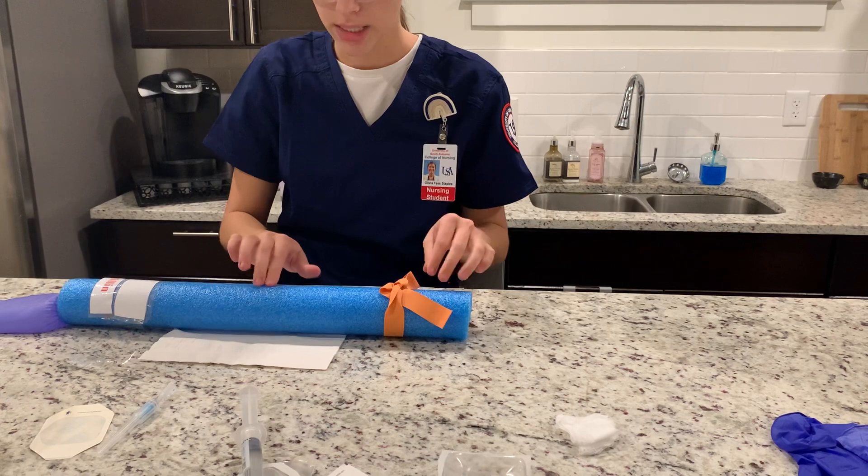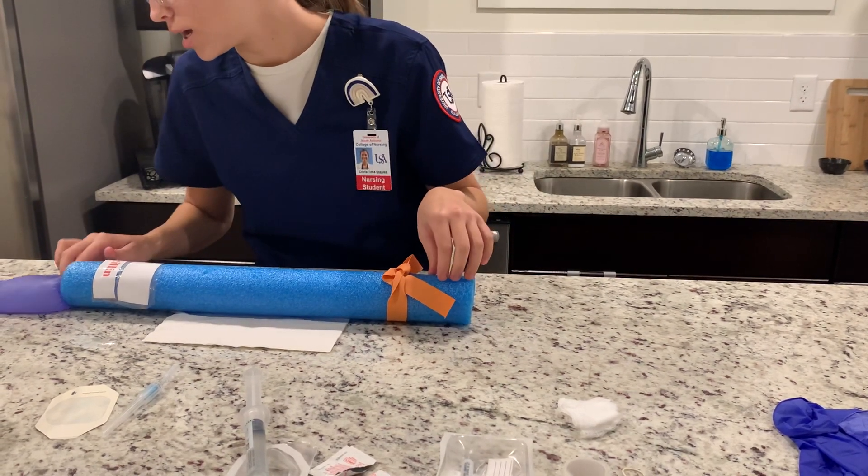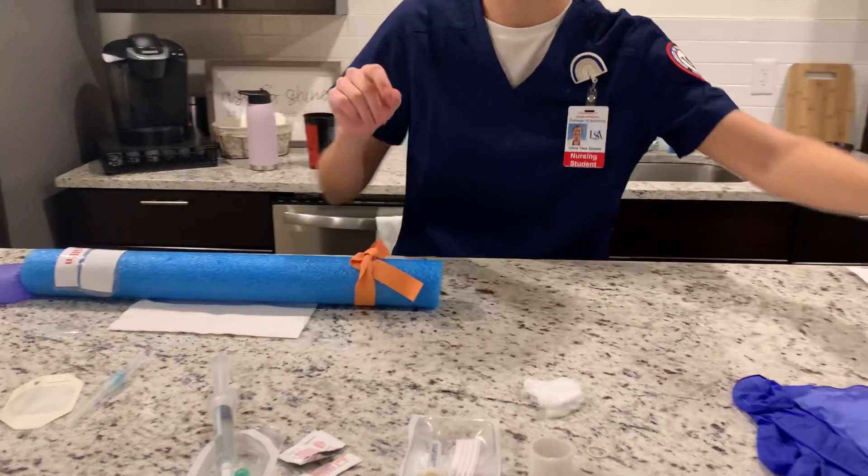Before I do that, I'm going to assess the appropriateness of the vein. I'm going to check the radial pulse of the patient. And now I'm going to put on my gloves.